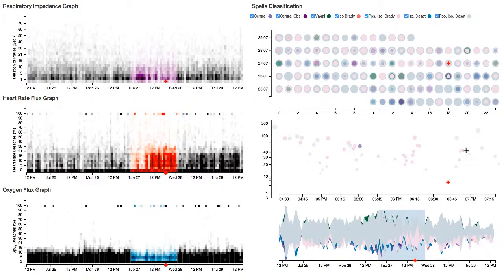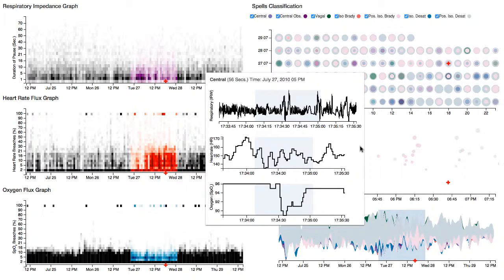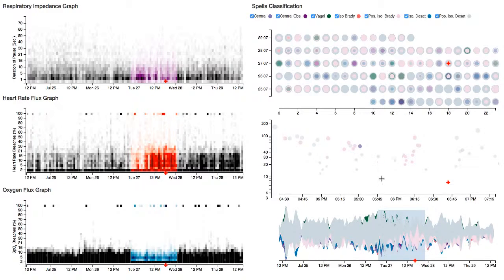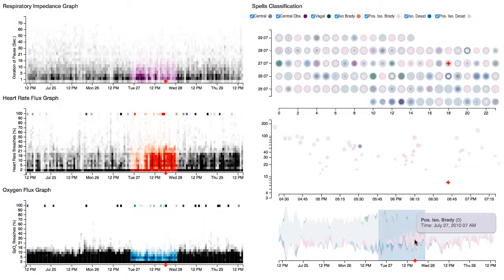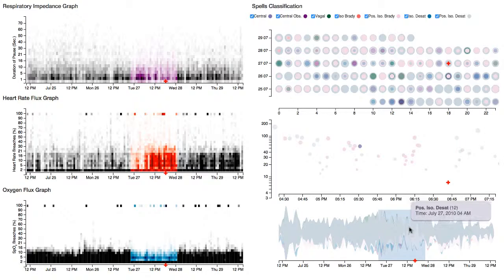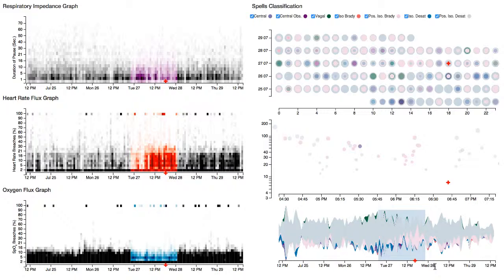The analyst then sees the central event classification and clicks on it. The raw data display then appears and the analyst is able to follow the raw trace to get a detailed insight as to what happened at the bedside. The analyst then moves on and looks at the streams graph, which shows that during that point of suspicion, a higher number of possible isolated bradycardia events occur, while the number of desaturations decrease. The analyst is now satisfied with the analysis and concludes.